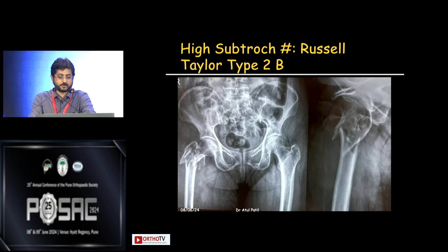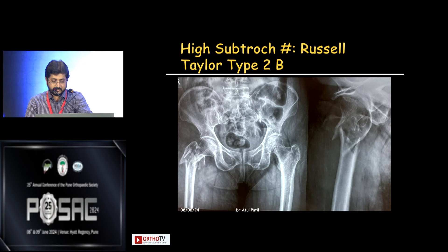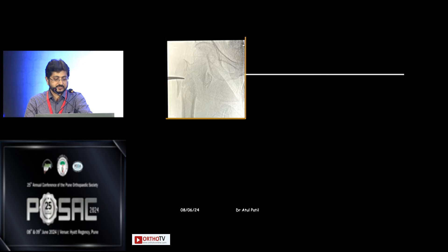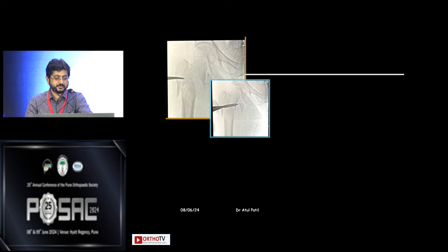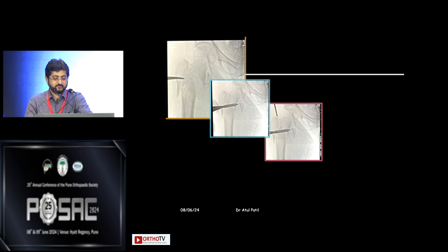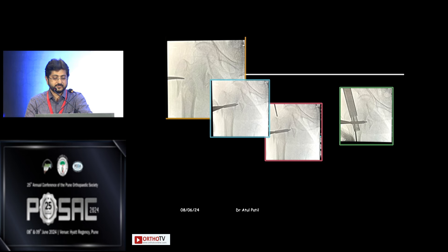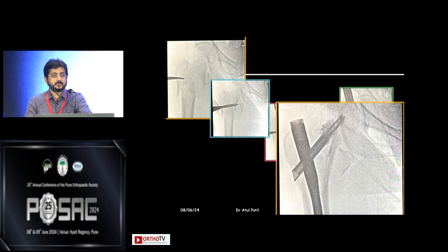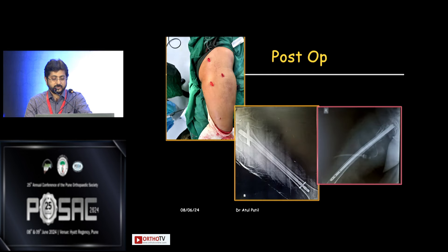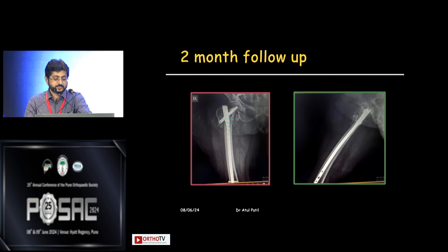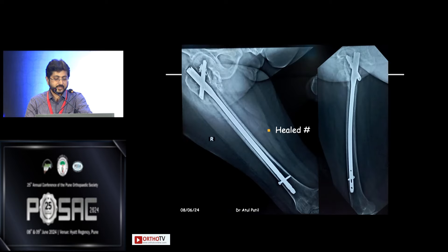This is a case of high subtrochanteric fracture, Russell-Taylor type 2b — you can see how comminuted it is. In the lateral position, I use a spike to reduce the medial neck. Once the neck is reduced, I go for an entry point medial to the tip of the trochanter, then the proximal reamer, and place a cement-augmented TFNA with spiral blade. These are the only incisions for this comminuted IT-subtrochanteric fracture. At two months follow-up, this subtrochanteric fracture is united, fixed minimally invasively.